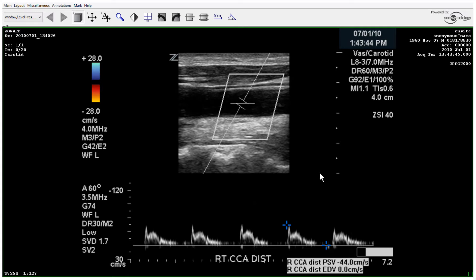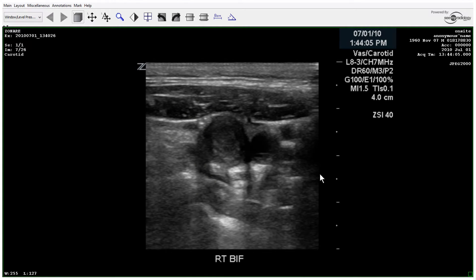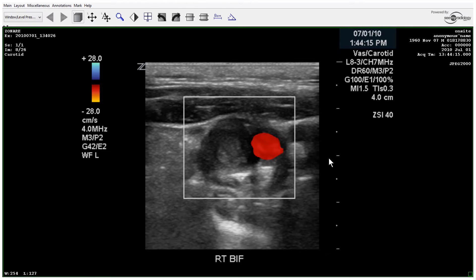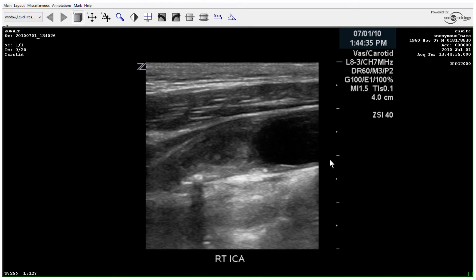You have that sharp upstroke but there's hardly any diastolic flow, so that should give you a clear clue as to what's going on upstream. Then we get to the bifurcation, and you can see the ICA and ECA. The ICA looks pretty filled, so you should be thinking near occlusion if not total occlusion at this point.